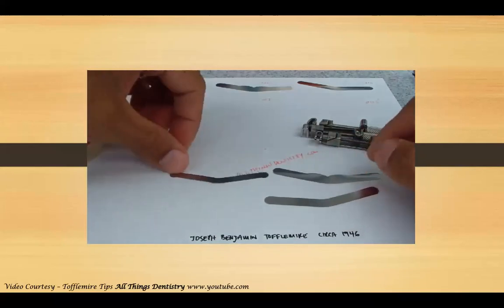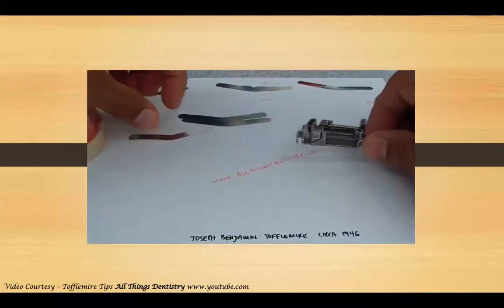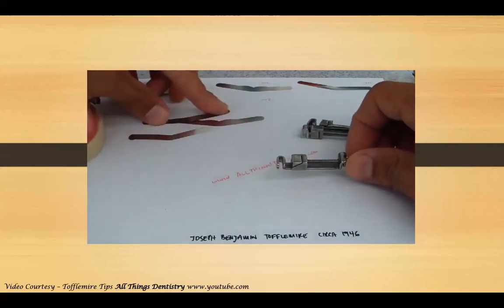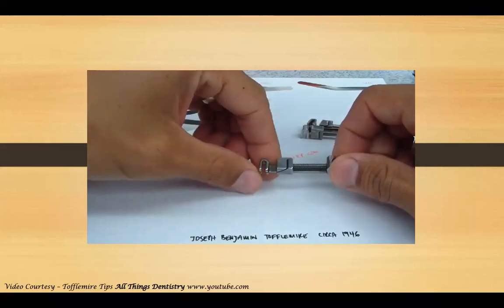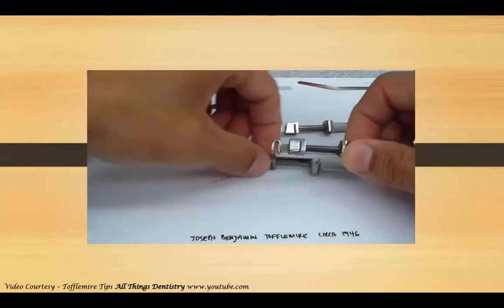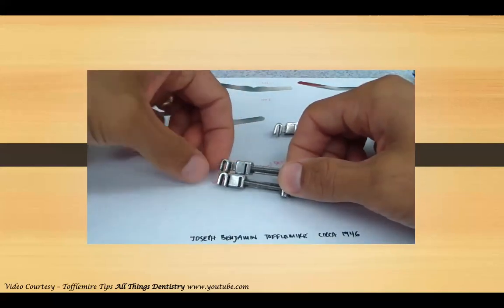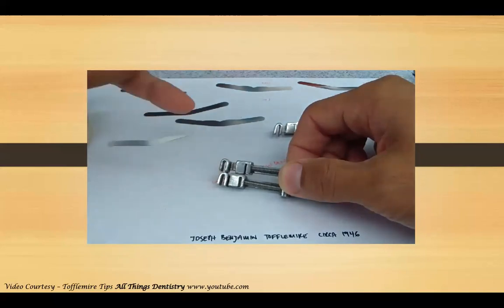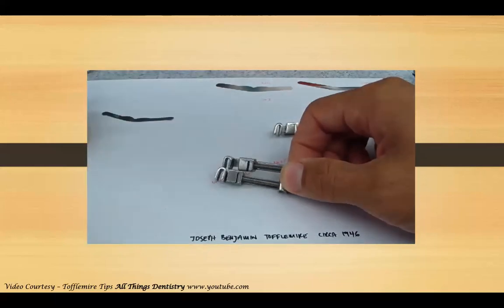Then there's these pedo bands. Occasionally, I'd be handed a Tofflemire matrix with the band already in it, and when I go to tighten it, it never seemed to tighten properly. I finally figured out why. There are 2 different types: the pedo version and the regular version. The pedo version is just short enough to become frustrating when trying to tighten your matrix.